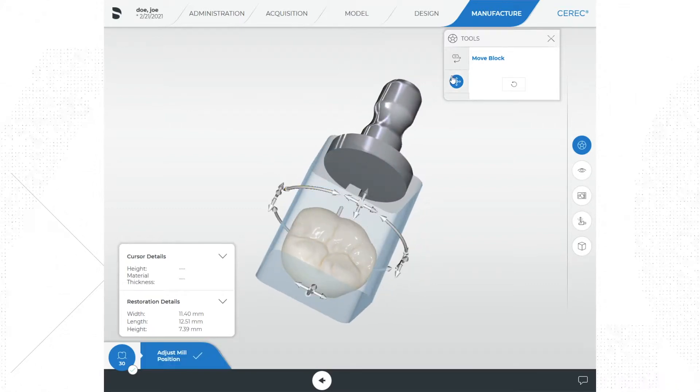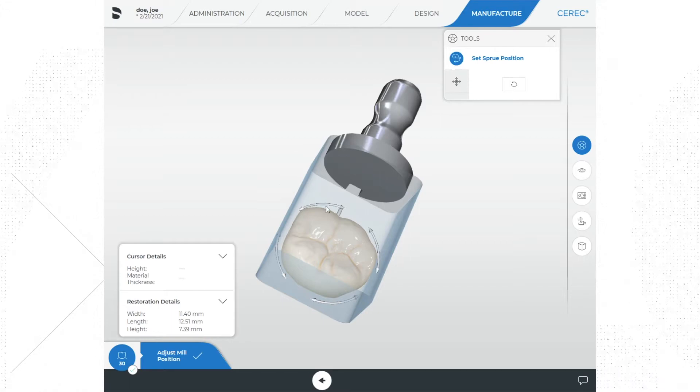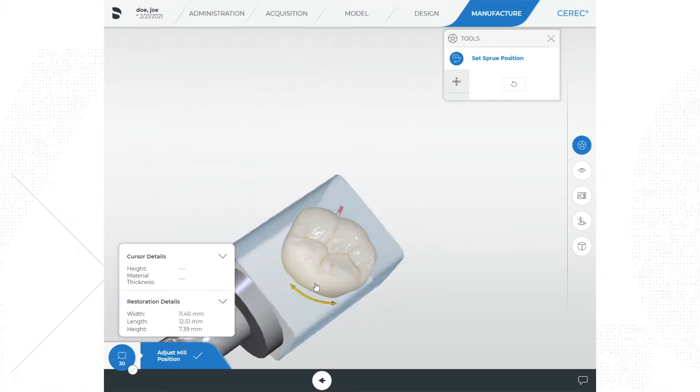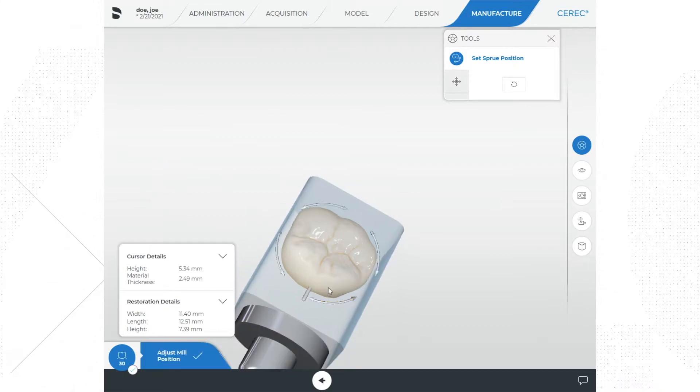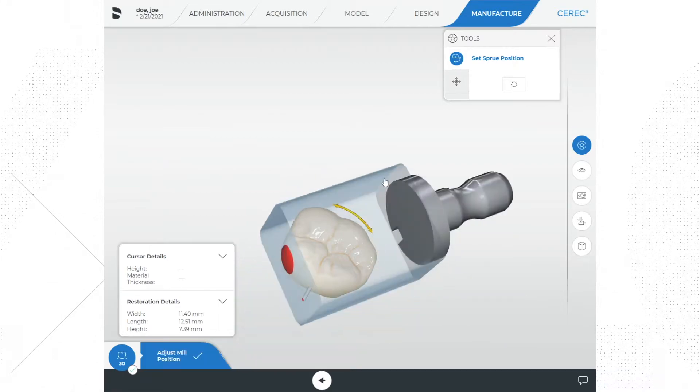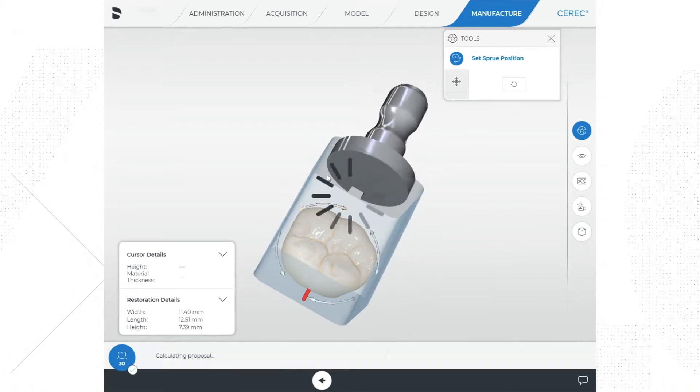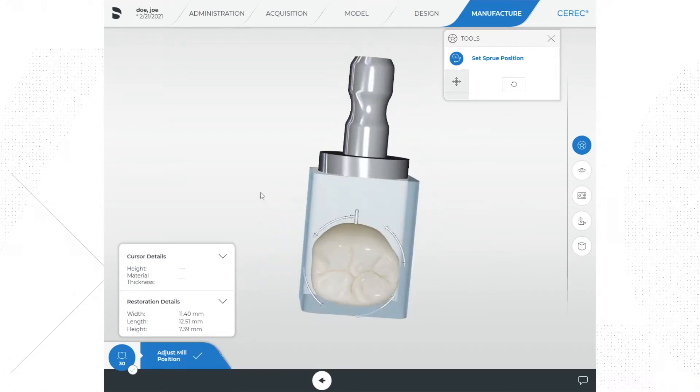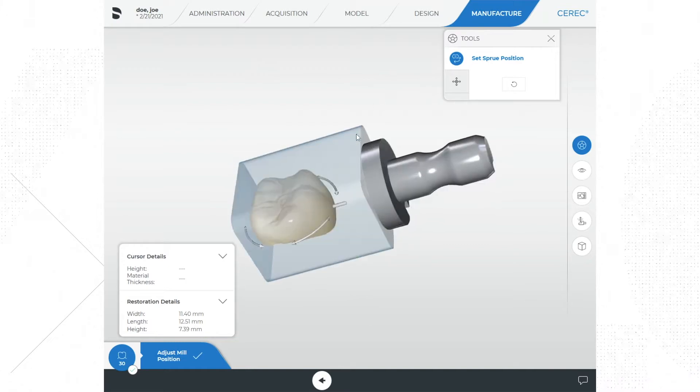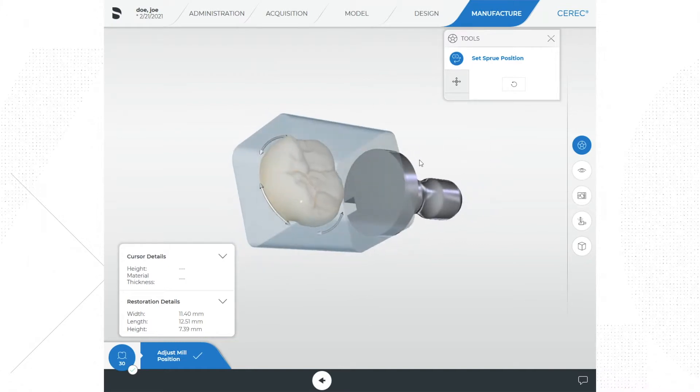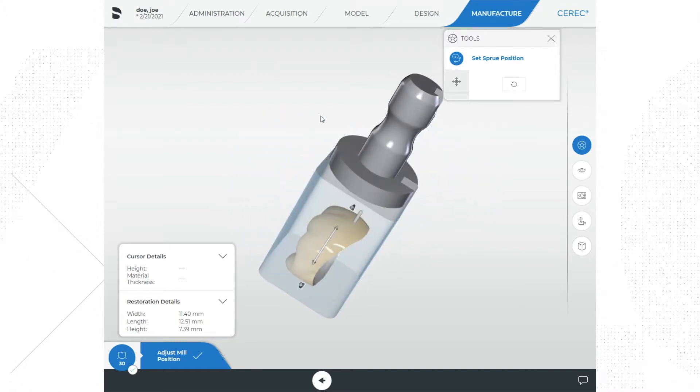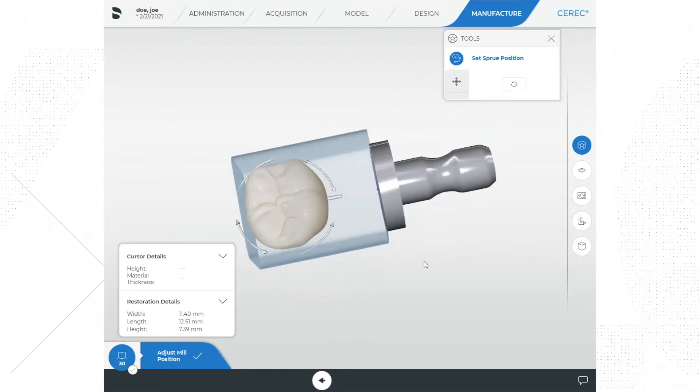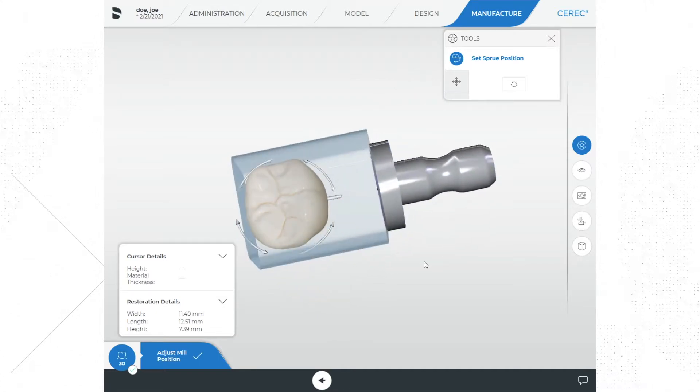It's best not to move the restoration closer to the mandrel as this will cause longer mill times and instrument wear. Sprue tools allow you to rotate the restoration within the block to set the sprue where you would like it. The software defaults to the most efficient milling but may leave the sprue on the mesial distal contact area, which is not ideal. I will typically try to position the sprue on the lingual of the restoration if possible, but sometimes you just place it where it works.